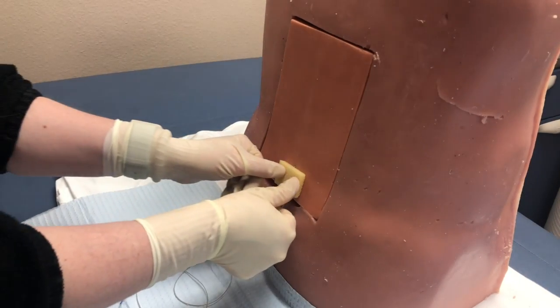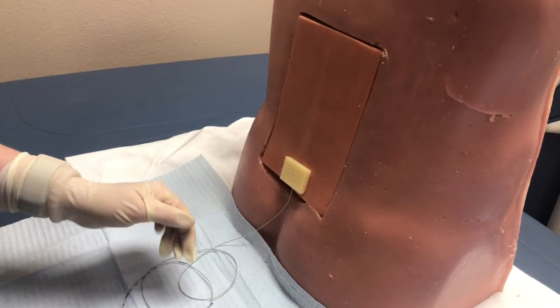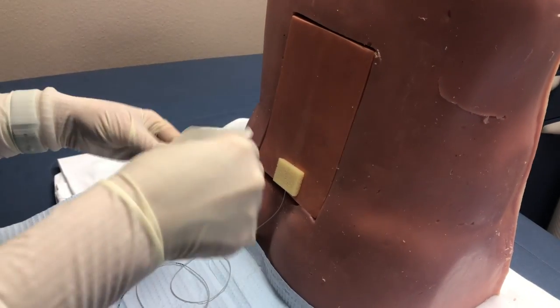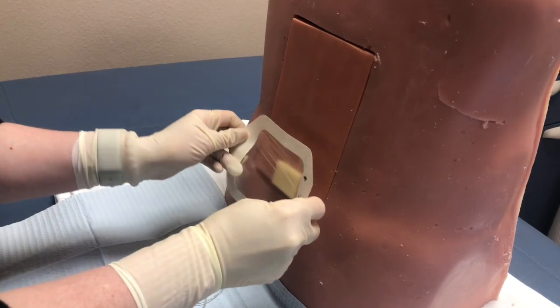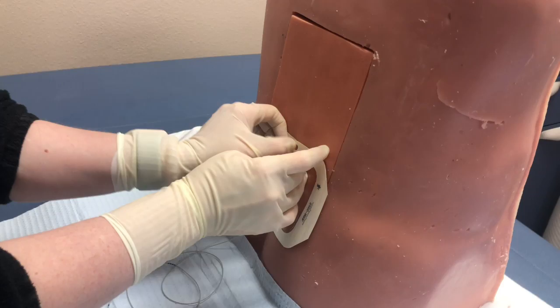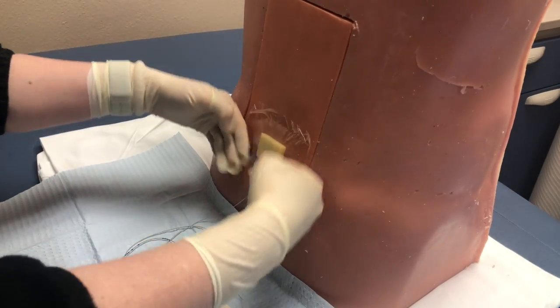Secure the epidural at the site with an adhesive foam dressing. Secure the epidural catheter and apply a Tegaderm to ensure the epidural catheter position does not change. Additionally, it is common to tape the epidural catheter, as these catheters are often in place for extended periods of time.